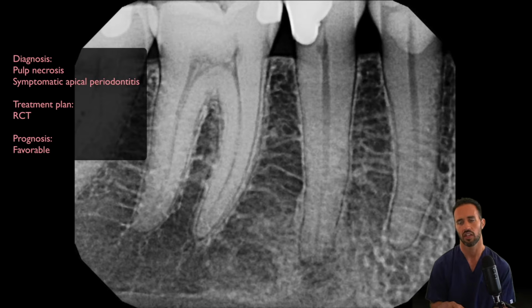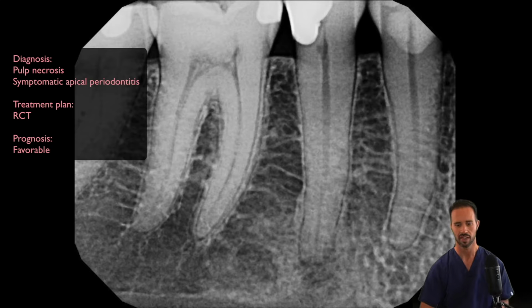So what you might end up having happen in these 1 in 50, 1 in 100 cases where it's completed in a single visit and it's a necrotic case, you may have to remove the entire root filling, re-disinfect the tooth, and possibly leave the tooth open. So you're going to need to make this decision fairly regularly, like I mentioned, but there's a lot of factors that go into it. All right, so let's get into it.